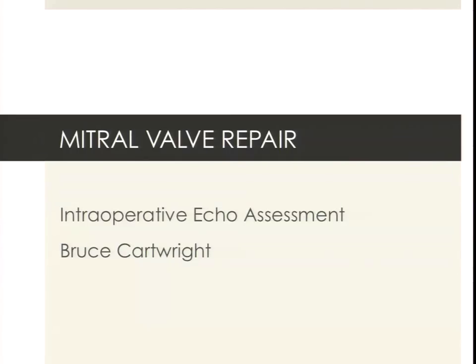When you're accessing from the groin, to avoid watching the cannula poke its way out through the ventricle, go through the following steps. Watch it in the IVC first, follow it up into the right atrium. Look at the line in the right atrium, make sure the line is not your PA or your CVL. Watch it go into the SVC. Be aware that most of the cannulae come with trocars or dilators that go in front of them. Watch the trocar come into the right atrium, watch it negotiate in the SVC. If you don't do those steps, you will see the trocar or the cannula out the side of the ventricle.